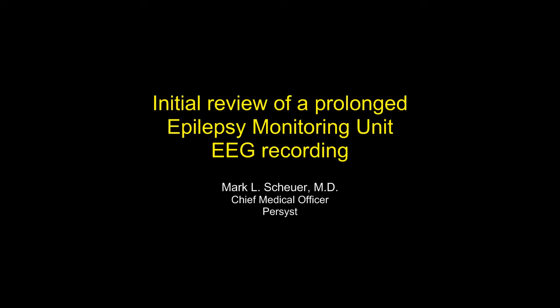The review of a prolonged EEG is a time and resource intensive process. It often involves the efforts of more than one person. In this video, I'll be demonstrating how I use Persist's EEG analysis software to rapidly identify seizures in a typical epilepsy monitoring unit recording.